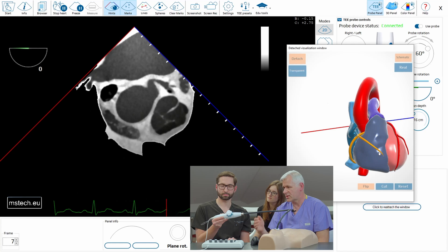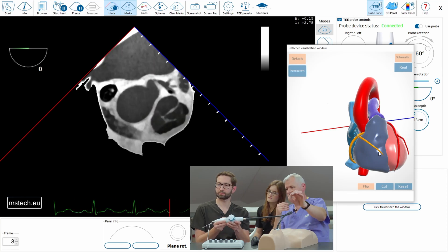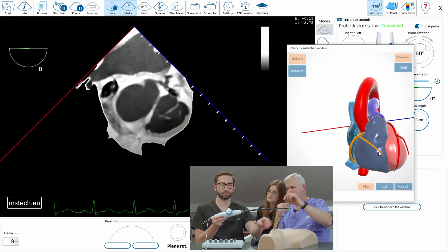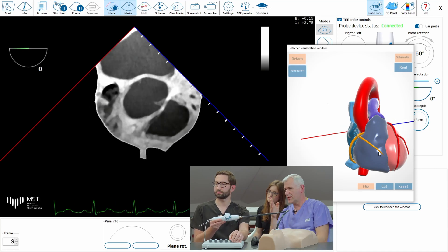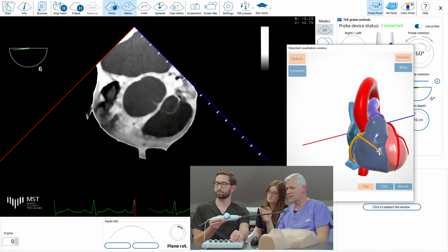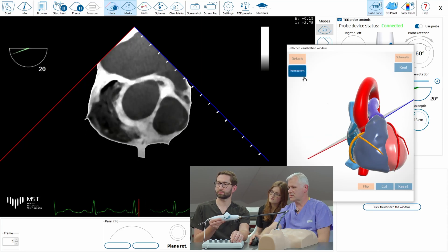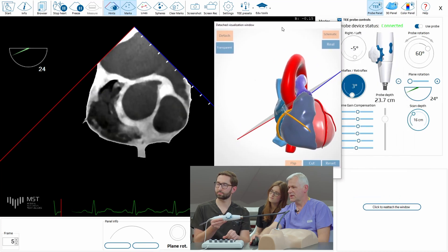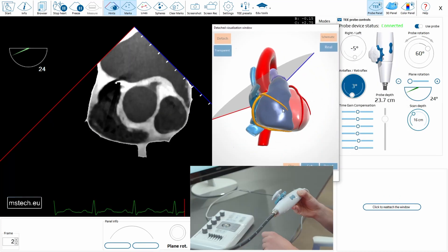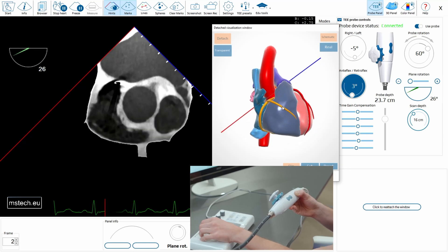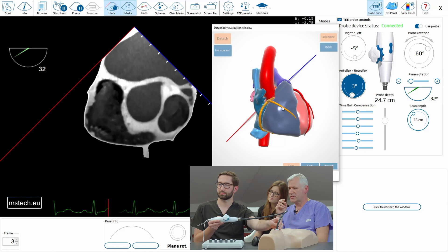In order to see the cross-section of this aorta you have to correct the angle. Go slightly deeper — you see more and more elliptic shape. To correct it, look at the model. You have to slightly increase the angle of the plane to approximately 30 degrees, then go slightly deeper, and keep the aorta all the time in the center.